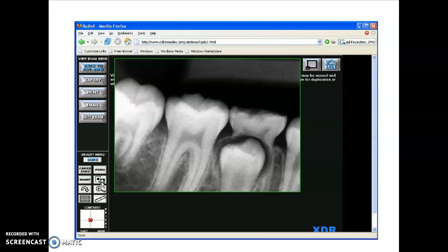I've shown you images of the polarized radiographs. Sometimes, again, that makes it easier to see things or explain to the patient. You'll also sometimes see images that have been put into, I call it sepia tone. It's like the brown rather than blacks and grays. It's brown and tan. Again, sometimes that's just easier on the eyes, and it's easier for dentists to be able to see certain things.